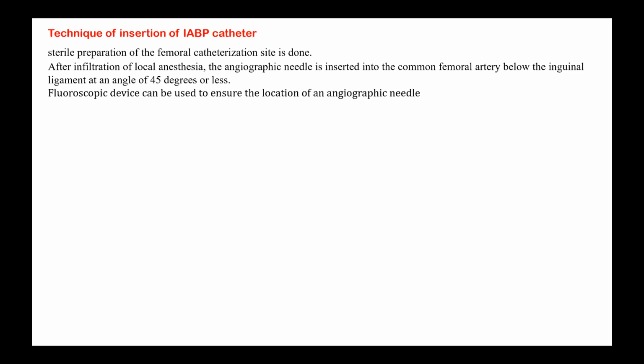guide wire. And after inserting the guide wire to adequate distance, you remove the pilot needle which you use to identify the vein, and then use a dilator over that and then make a passage, and then remove the dilator and insert your central catheter and remove the guide wire. So that is the Seldinger technique that you use. And before inserting the dilator, you make a small nick at the skin so that the passage of the dilator will be easy. Same way you do here also, but here you use two guide wires, which I will show you.